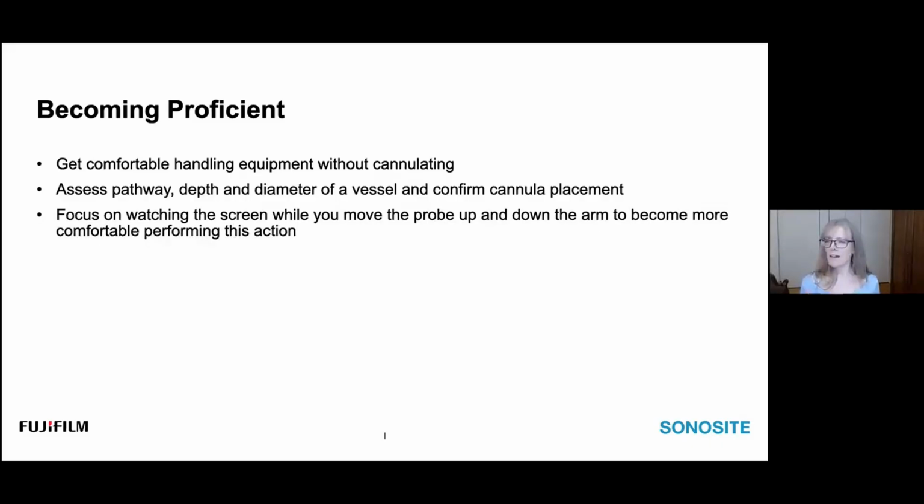I think I nailed that cannulation. I think the tip of that cannula is in the middle of the vessel. Why not use the ultrasound to see if that actually was achieved? Try to focus on watching the screen while you move the probe up and down the arm to become more comfortable at performing this action.